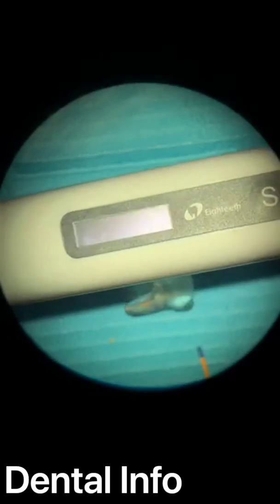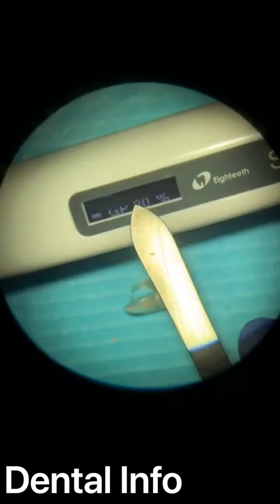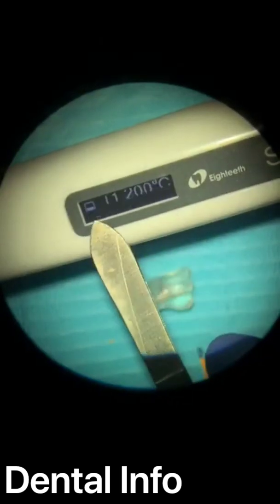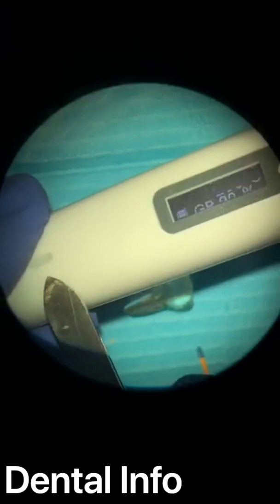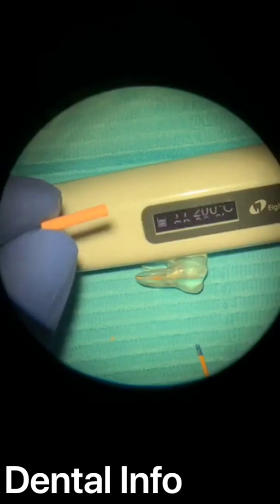Okay, I will switch it on, and I will choose 200 degrees to heat the gutta percha up to 200. And I have here, you can see the percentage of gutta percha inside. So the device will tell you if you have enough gutta percha inside. What I like the most here is that the gutta percha comes in bar form. I will show you now. It's gutta percha bars, as you see here.